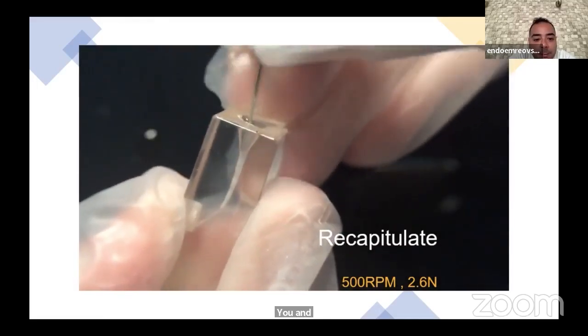You make your irrigation procedure, you make the recapitulation.